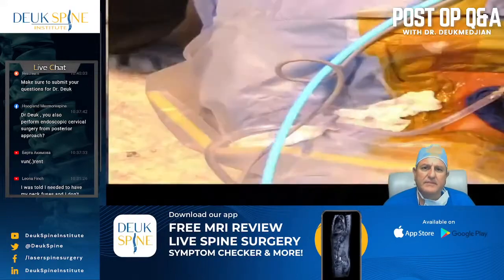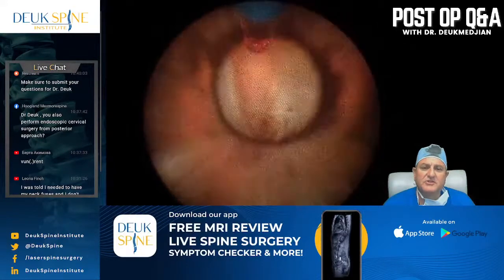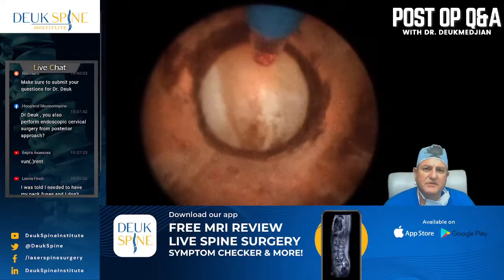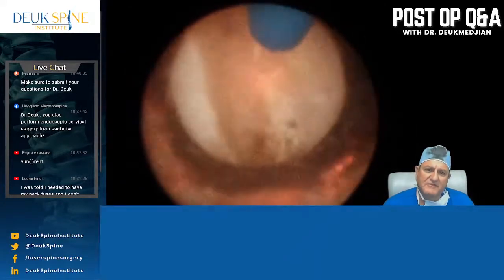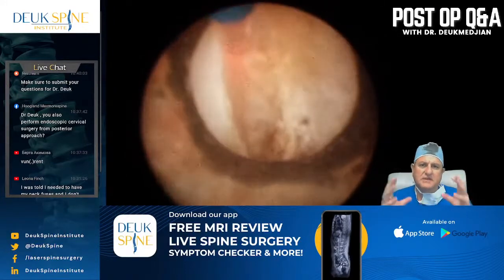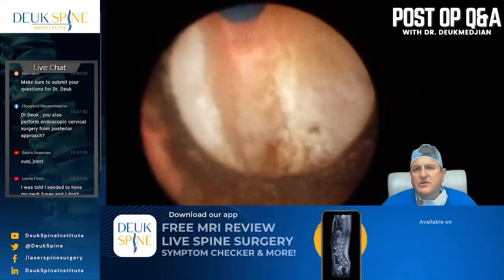We looked at his MRI, and he wanted to fix the one disc that was the worst, pinching the nerve. That was the C6-7. And when we got in there, you can actually see in the footage going on behind me during the surgery that there was a lot of collapse of the disc, degeneration of the disc with spinal stenosis, cervical spinal stenosis. That was happening in the left foramen, and it was not a soft, fluffy disc that was pushing on the nerve. It was calcium, bone spur, scar tissue, herniated disc, and inflamed annulus. So it's a combination of a bunch of stuff just wadded up, pushing on the nerve root. Now I got that nerve root completely decompressed, and hopefully the nerve will make a recovery.